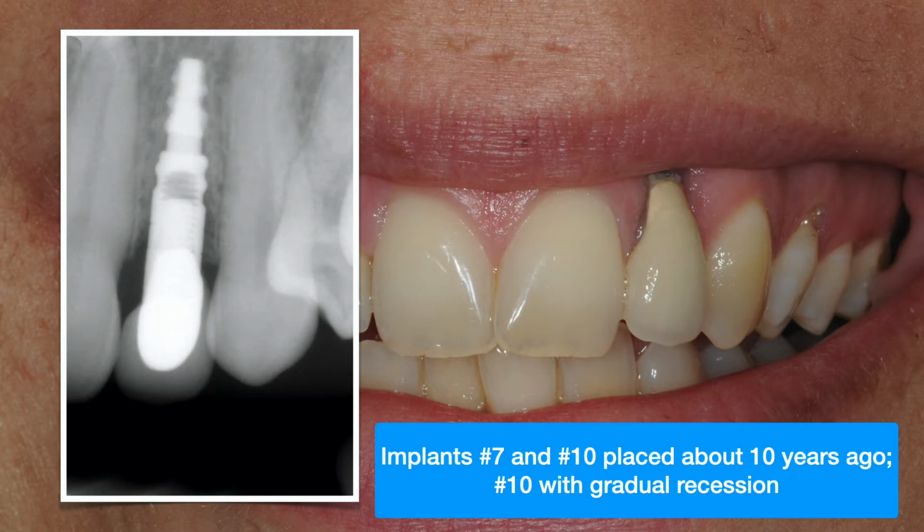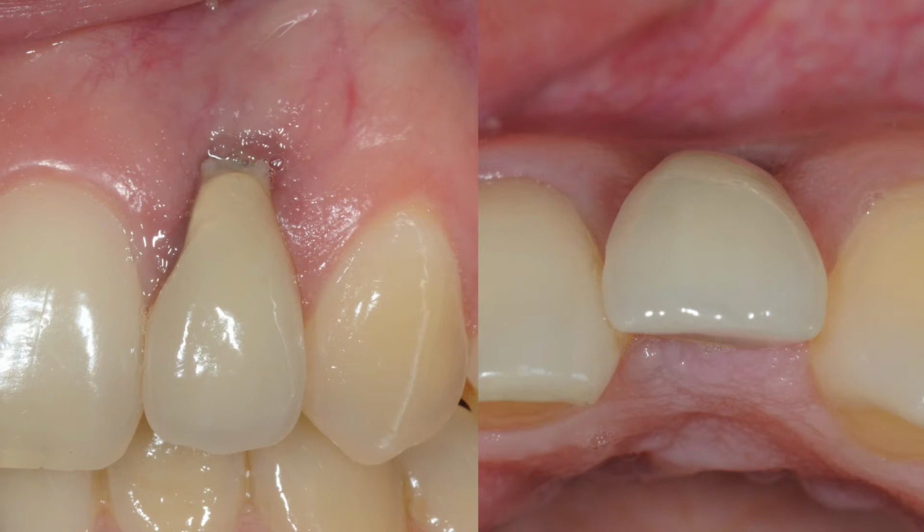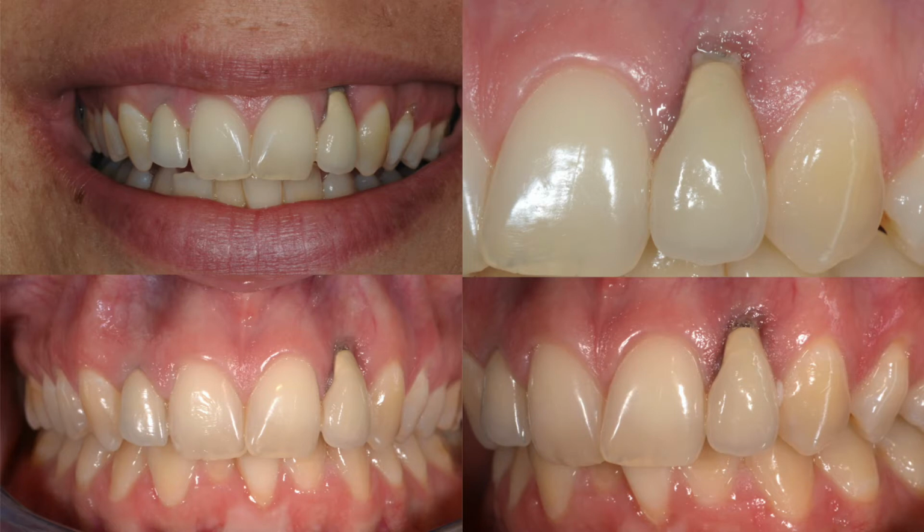This is the x-ray that she had initially: implant, restoration, abutment. This was placed in Europe, so I'm not really sure of the type of implant, a different brand and brand name. You can see the over-contoured restoration, which we'll see in a sec, and that's actually food impaction along the gingival margin, which contributes to the gingival recession. But her major chief complaint was, I don't like my smile. And that's pretty much her smile.